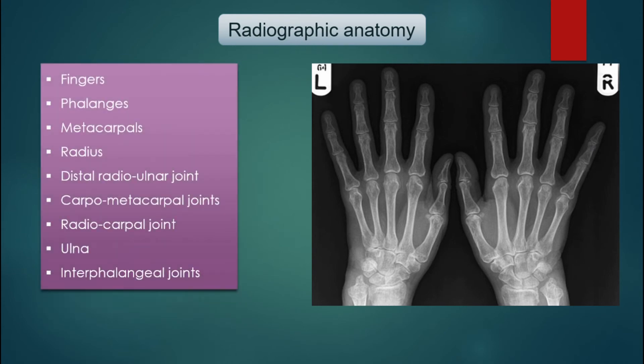Radiographic anatomy: fingers, phalanges, metacarpals, radius, distal radio-ulnar joint, carpo-metacarpal joint, radiocarpal joint, ulnar, interphalangeal joint.